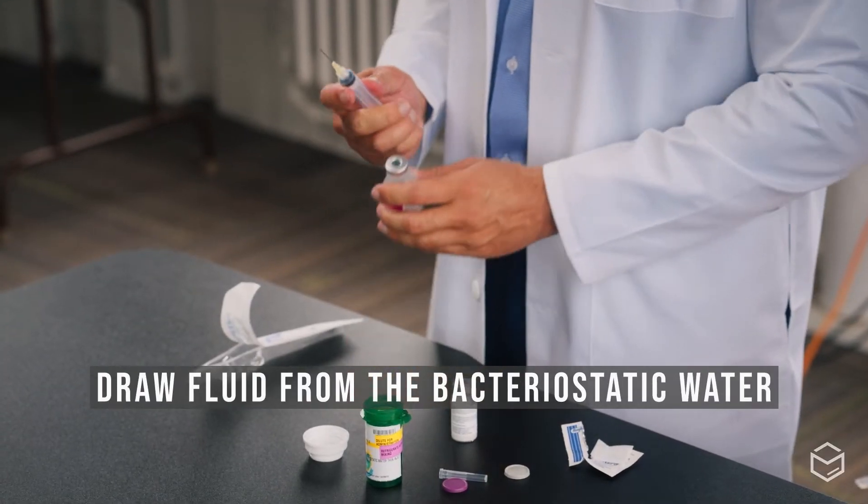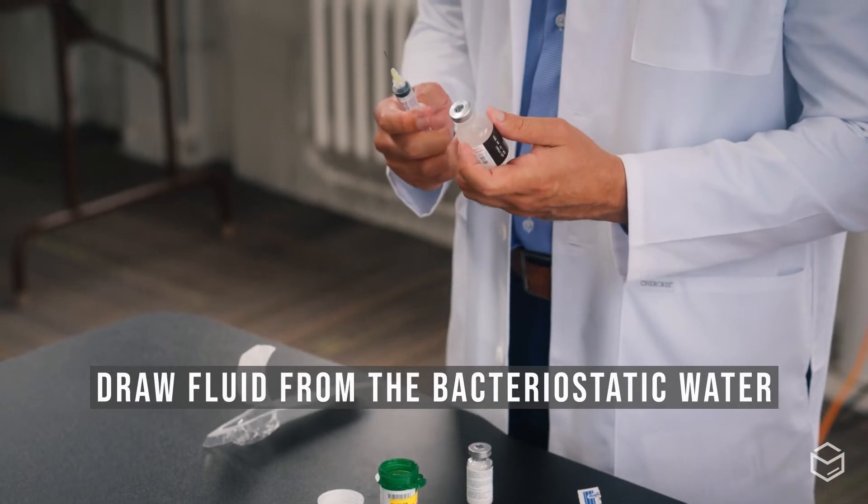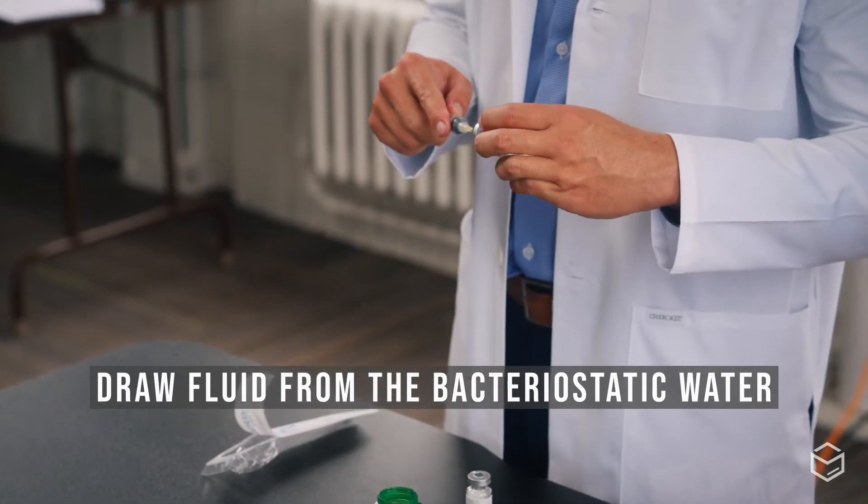Now draw up the amount of fluid you want from the bacteriostatic water. For this medication, I'll be drawing up 7.5 milliliters, which can also be written as 7.5 cc's.